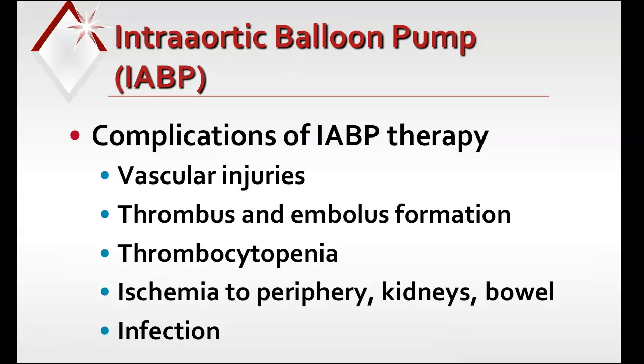So patients that are receiving balloon pump therapy are also prone to infection. It could be local, it could also be systemic, and if you have any type of infection, those require catheter removal. So to reduce these complications, it's very important for the nurse to perform cardiovascular, neurovascular, and hemodynamic assessments a minimum of every 60 minutes. But most of the time, especially if they're brand new out of surgery, we should be doing assessments every 15 minutes. It's going to depend on your patient's hemodynamic status. Are they hemodynamically stable? If they're stable, you can stretch it out more to 60 minutes. If they're unstable, definitely 15 minutes would be good for you to watch your patient.